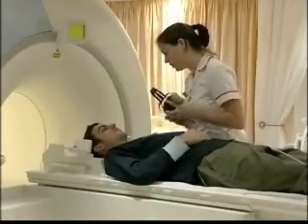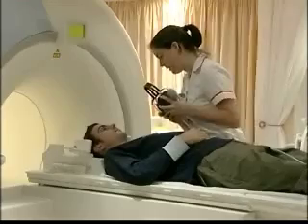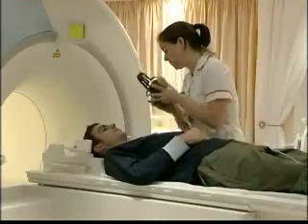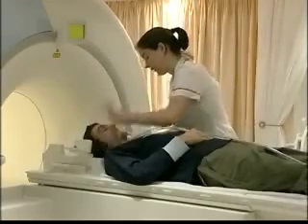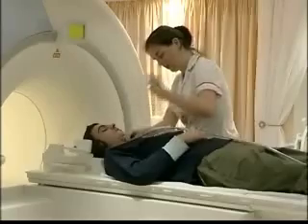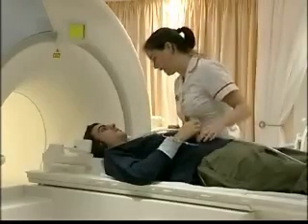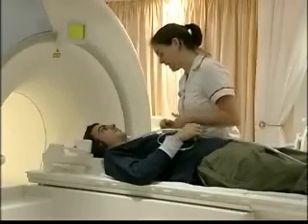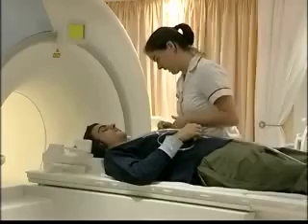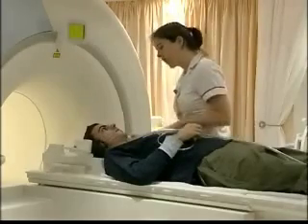To obtain images, the patient is placed in a large, static magnetic field produced by a superconducting magnet. This powerful field, typically one and a half Teslas in strength, causes the nuclei of the hydrogen atoms in the body to line up.